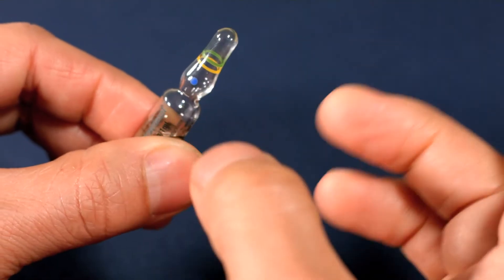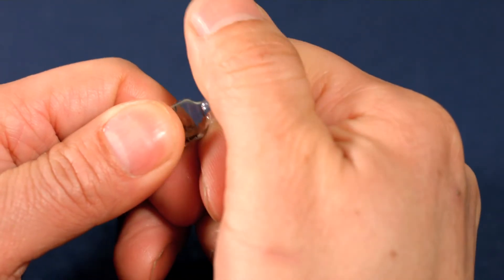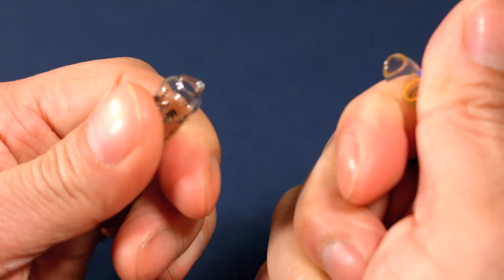Tap the ampoule to remove any liquid from the top. Now, using the blue dot as a placer for your thumb, snap the ampoule away from you.